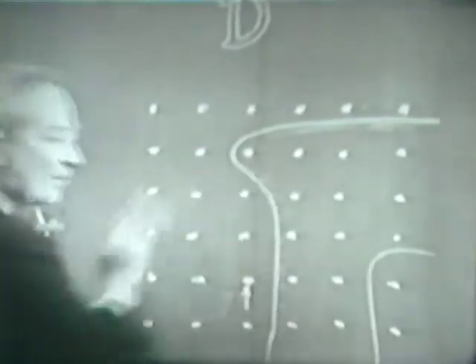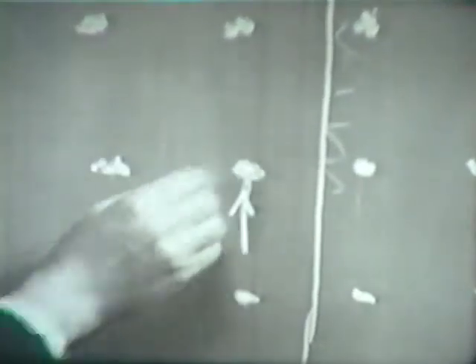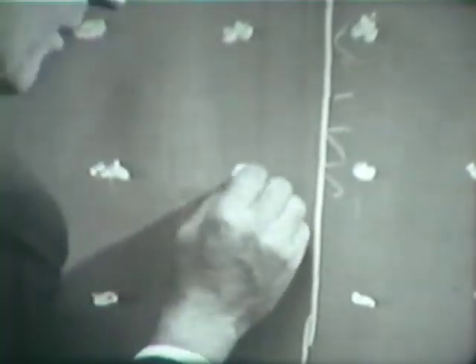1, 2, 3. Yeah, that's what I want to do. Suppose it gets going from a previous point, and here it senses white. That's outside the letter. Okay. The computer is programmed to tell the spot, to tell the scanner, to make a 90-degree right turn when it stops and senses white. So it jumps to the right then. It makes a right turn and goes over to here. Now it stops and says, what color is it?